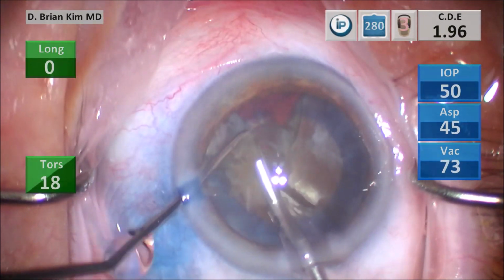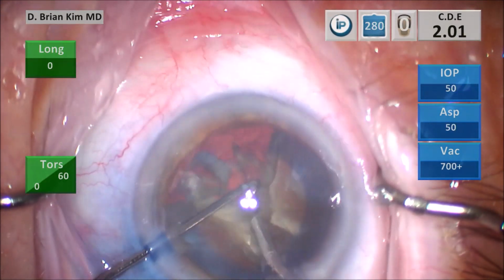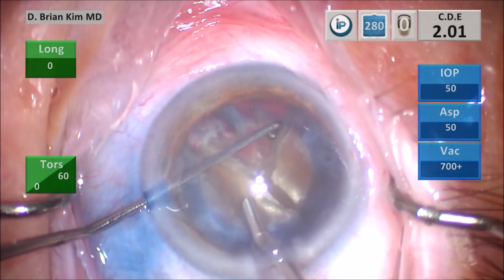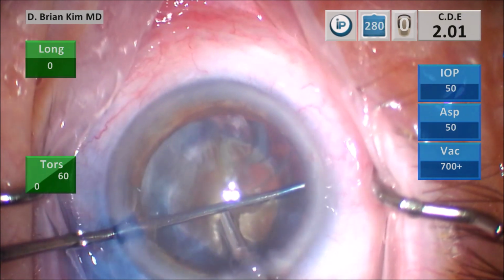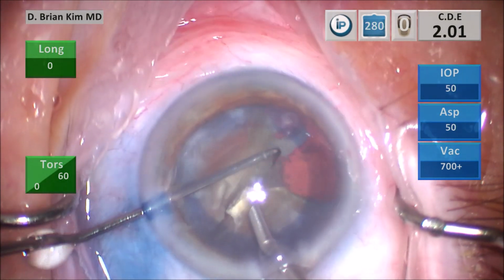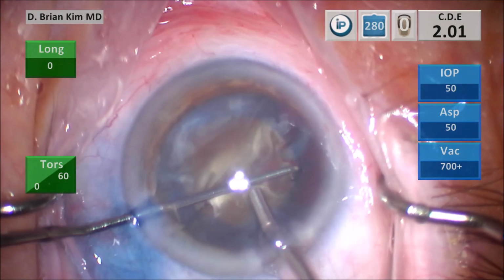And so that's kind of the technique with this very, very dense lens: go ahead and chop it, but then if there's any posterior adhesions, going after it separately with a little bit of vacuum, lifting the fragment up, and then going underneath the fragment and chopping the posterior adhesion. So that first quadrant is out.